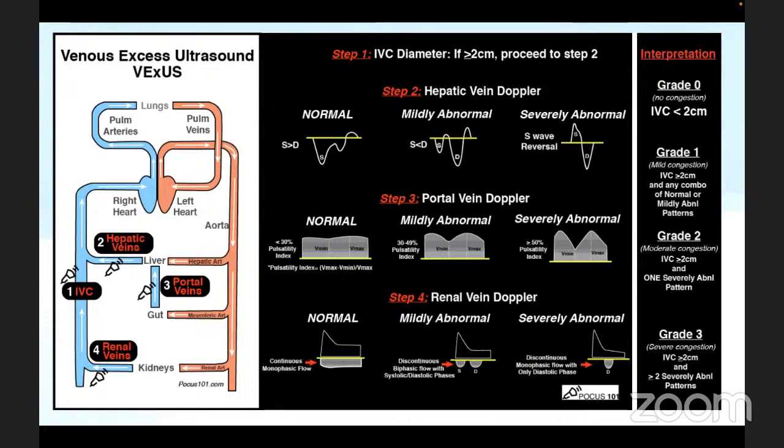Any intubated patient will be good to observe. Dr. Dinesh, what is pulsatility fraction? Pulsatility index, sir. Pulsatility fraction or ratio. Pulsatility ratio is the ratio of, I think, systolic minus diastolic divided by the systolic pressure, that we see in the arterial flow cycle. It should be kept less than 0.8 to 0.7, is what I remember, sir.